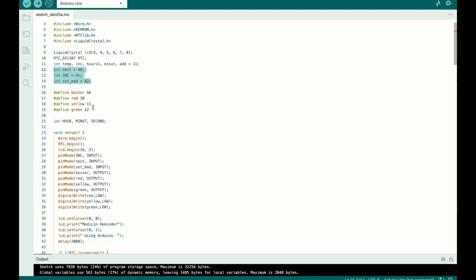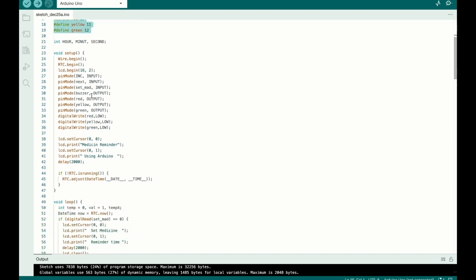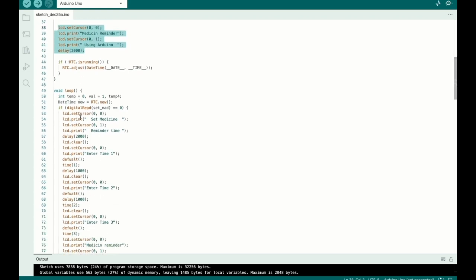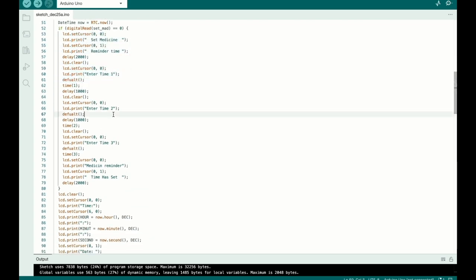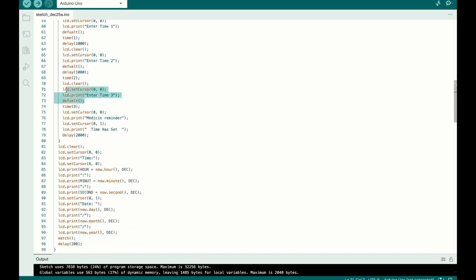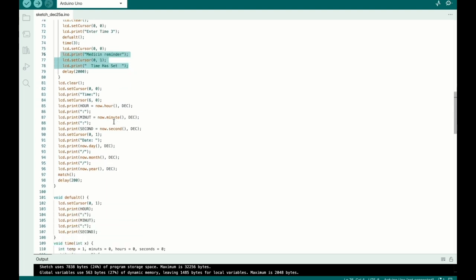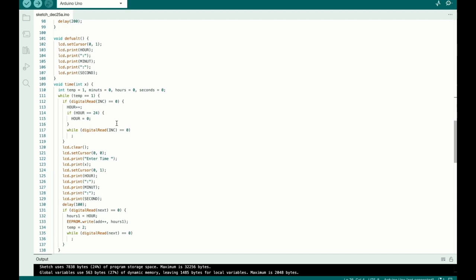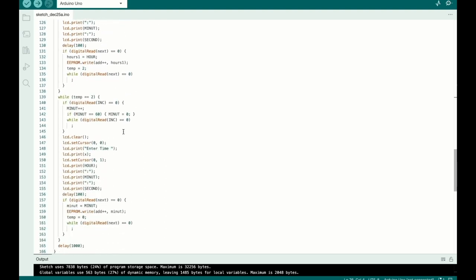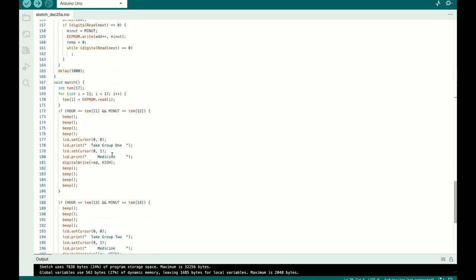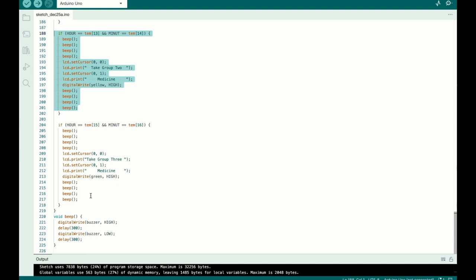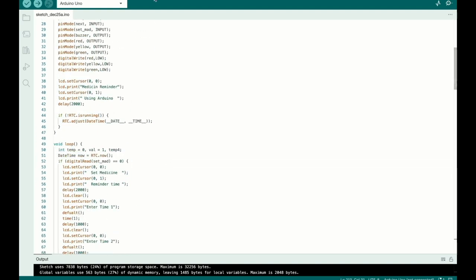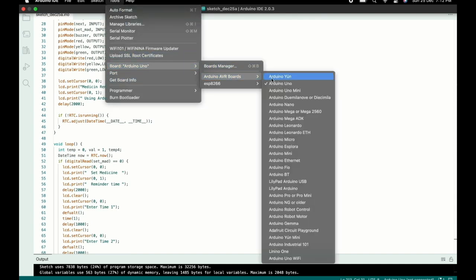Here are the buzzer connections. When the system starts, a welcome message is displayed on the LCD. When you set the timer, the LCD shows 'Medicine Reminder Time Set.' You can increment or decrement the medicine time values, and when the time is reached for group one, the LCD displays 'Take Group 1 Medicine' — it automatically turns off after one second. Similarly, when the second medicine time is reached, the LCD displays the second medicine reminder. Select the Arduino Nano board in the Tools menu and compile.